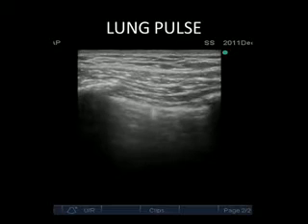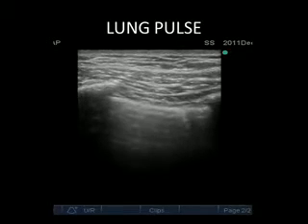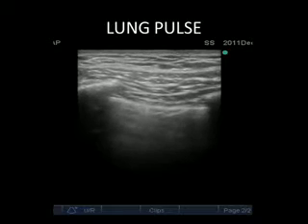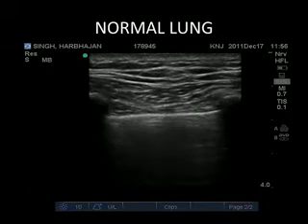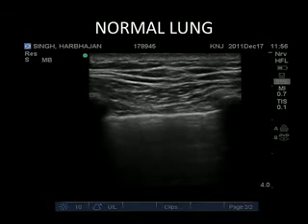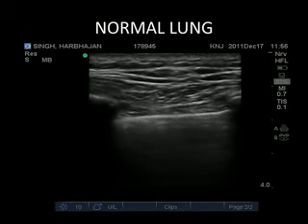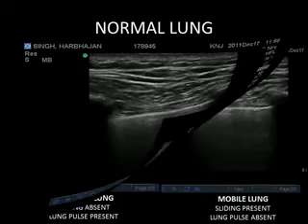The lung pulse is a pulsatile movement of the pleural line with each heartbeat, and its presence implies an immobile lung. In a normal lung, the lung sliding sign is present, A lines are present, there are no or minimal B lines, and there is no lung pulse.